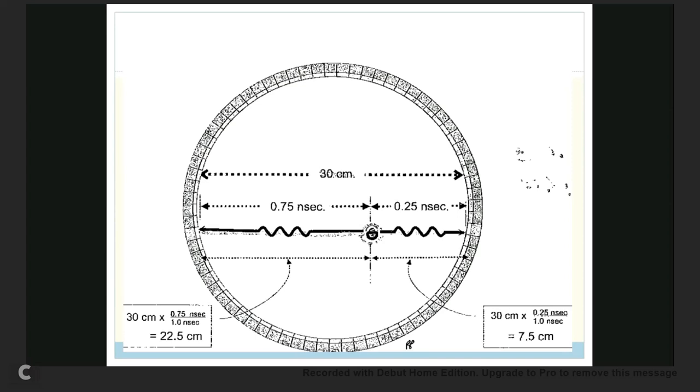That's why you have a larger patient. Do you want to give them more FDG or do you want to give them less? More, okay. Because you want to make sure that you have enough photons to actually strike the detectors, correct? Because you have a lot of body mass that you've got to get through, right? Okay, so if you have all that body mass to get through, what do you think? It's slowing it down, and it works as an attenuator as well. So you have to remember all those things that come into play. Okay?